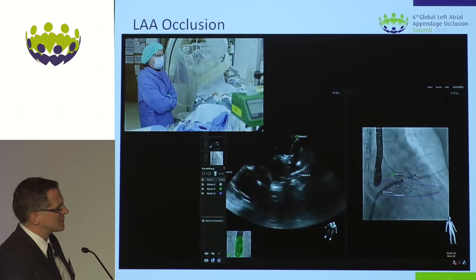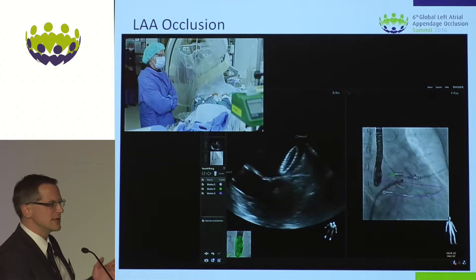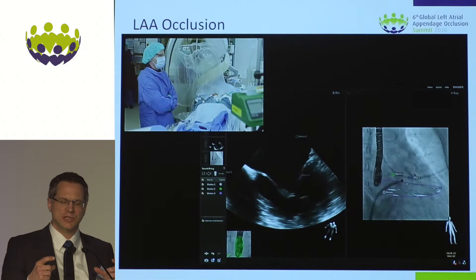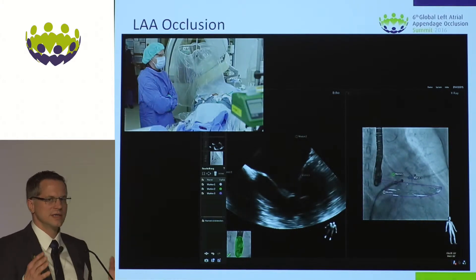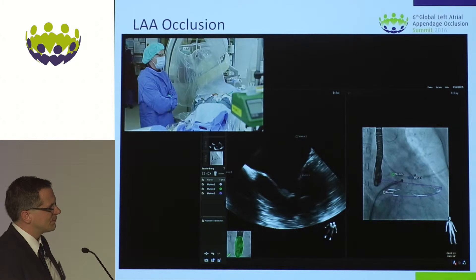Looking at the position now — circumflex artery visible, and part of the lobe is protruding a little bit. I think this is due to the length of the Amulet, which is longer than the ACP we started with, and also because this is a large Amulet which is compressed and the part of the lobe is protruding slightly. We discussed within the team whether to leave it here or not.